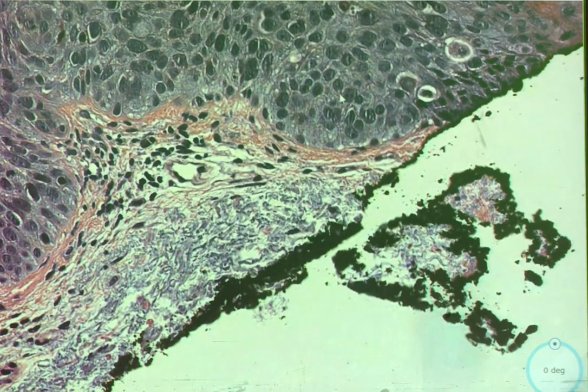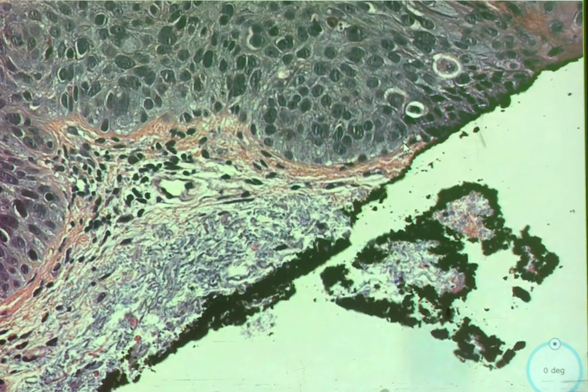It's like the same atypical cells going this direction, reaching the margin that we have. And we've decided this isn't atypia. We've decided this is cancer. So as was pointed out, this gets a note.